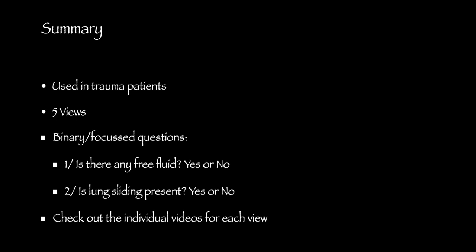So in summary, eFAST is used in trauma patients looking for the presence or absence of free fluid. 5 views are required, and remember the binary or focused questions. 1, is there any free fluid, yes or no, and 2, is lung sliding present, yes or no.